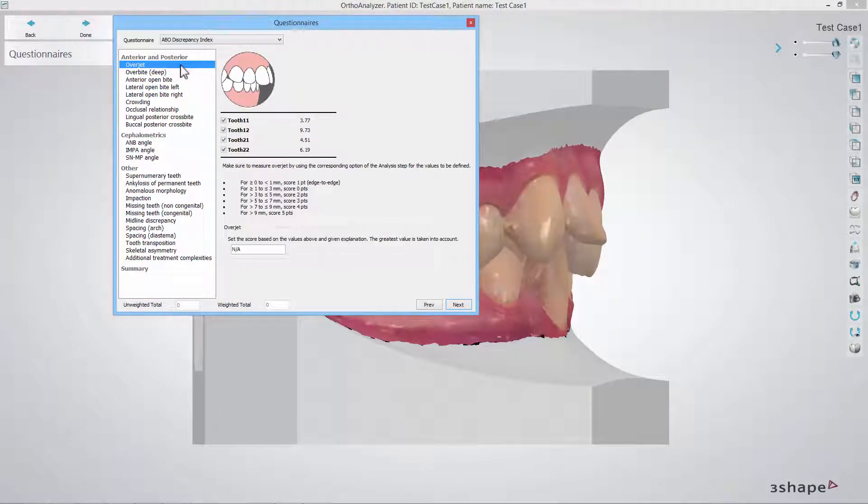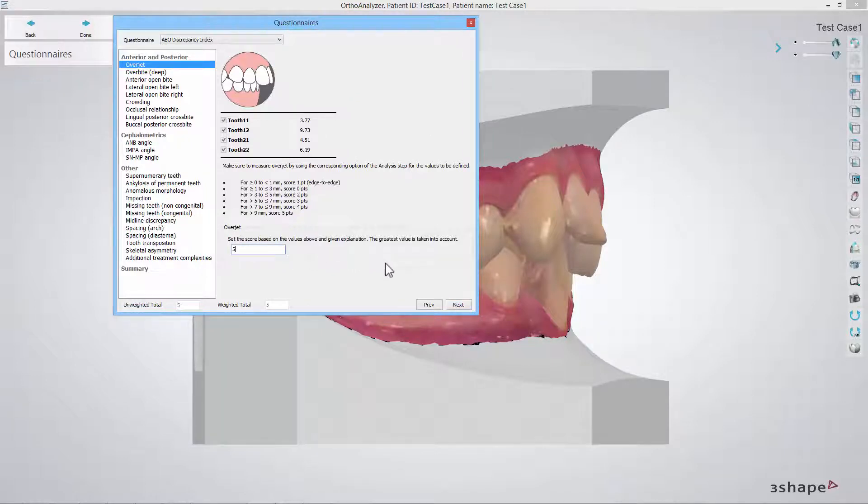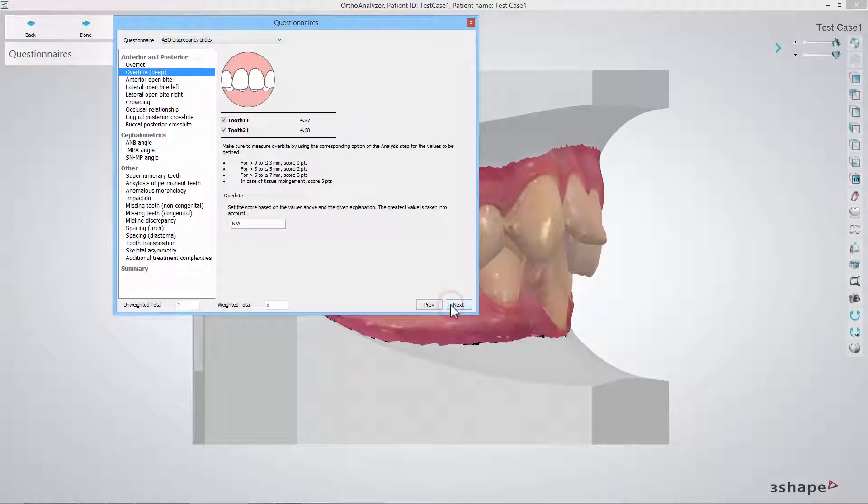In the overjet step all incisors are included in the assessment. Here you fill in the score that corresponds with the highest overjet value shown based on the instructions presented in this step. Fill in the corresponding score now. Please remember that this kind of workflow will repeat for the following steps.